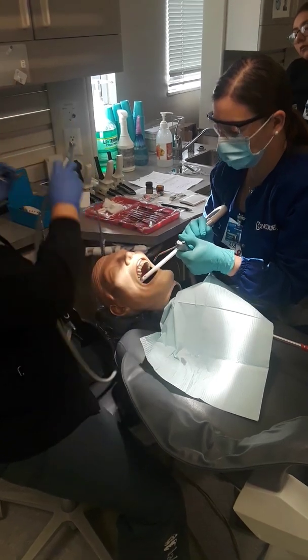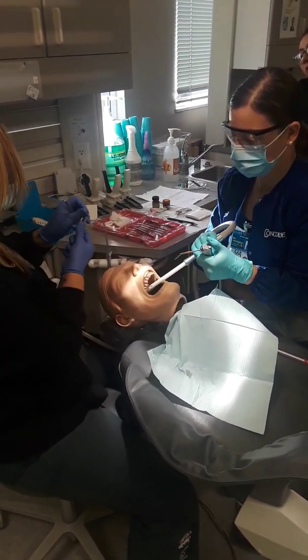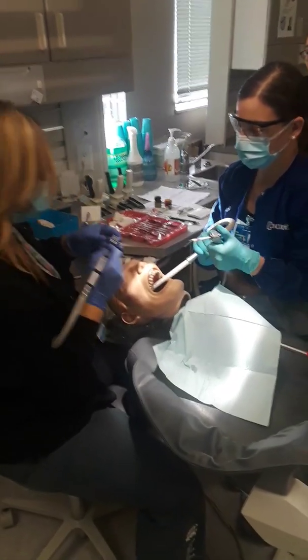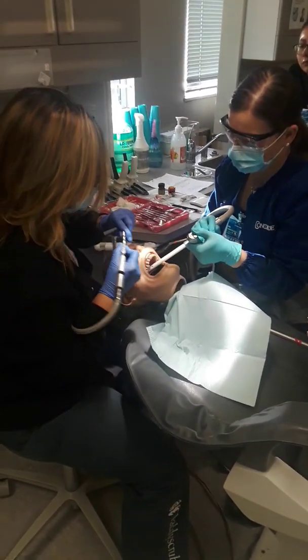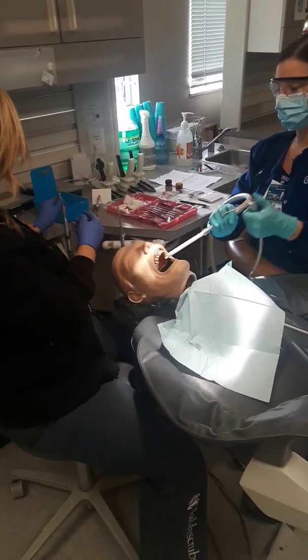Okay, so now I'll use my slow speed round burr, once that's complete with my high speed. Again, we're removing decay now at a slower rate than a high speed. Okay, go ahead and rinse.